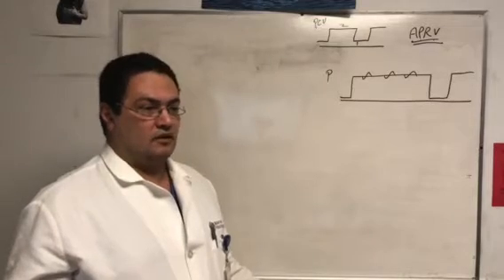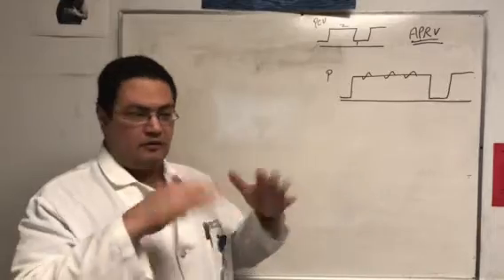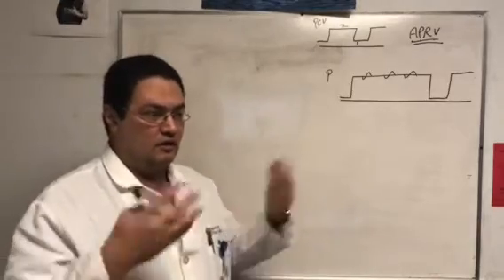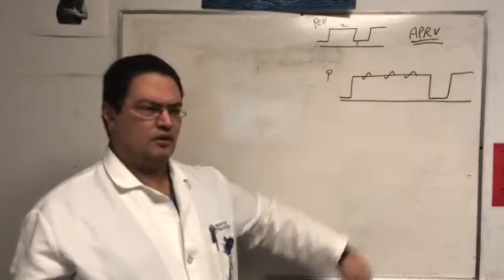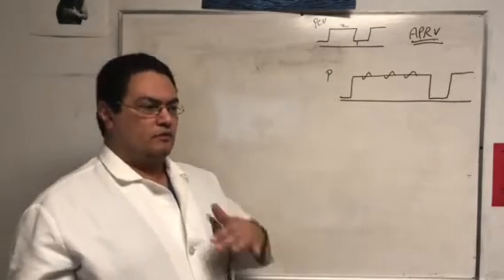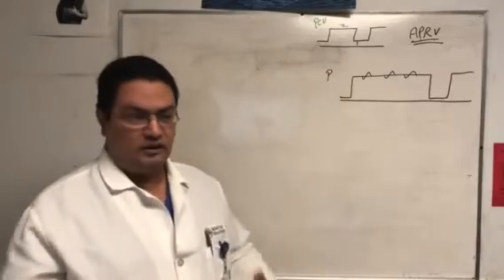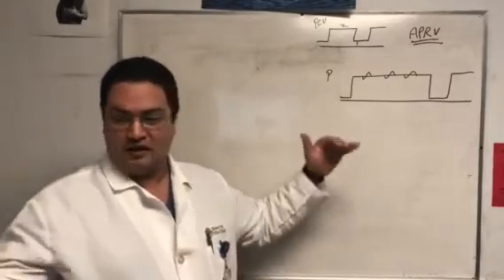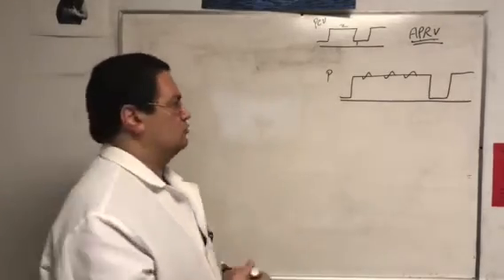You can breathe in the middle as if it's just a high peep, as if I just put him on the high peep and he's breathing completely at his will. And then it releases every once in a while. That's a little bit annoying, and goes up again. But for the majority of the time he's at that peep, just breathing over it. So that's much more comfortable.